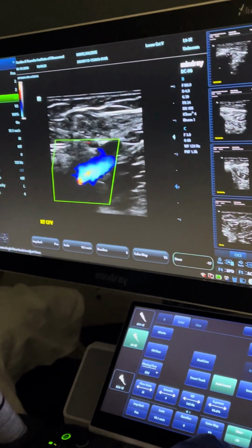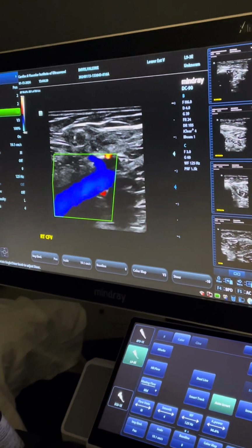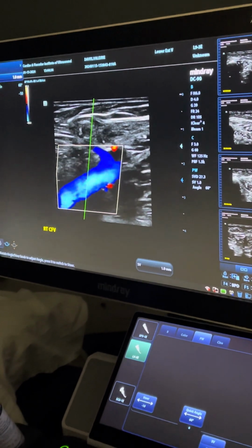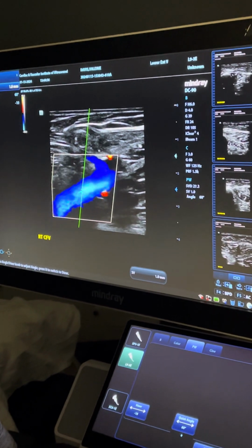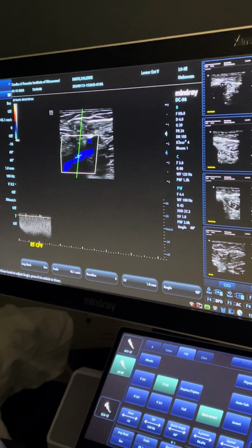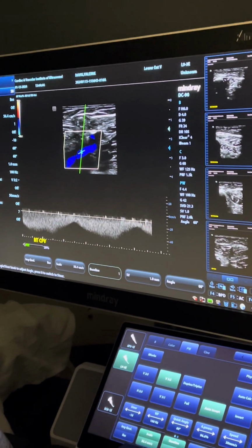Where do we angle? Towards the groin. I'm gonna say that 4,000 times. Okay. Venous flow, no dual screen. We're still utilizing our Doppler rules, center of flow, parallel to posterior wall. Before you do anything, before you go to squeezing, look at the vein.